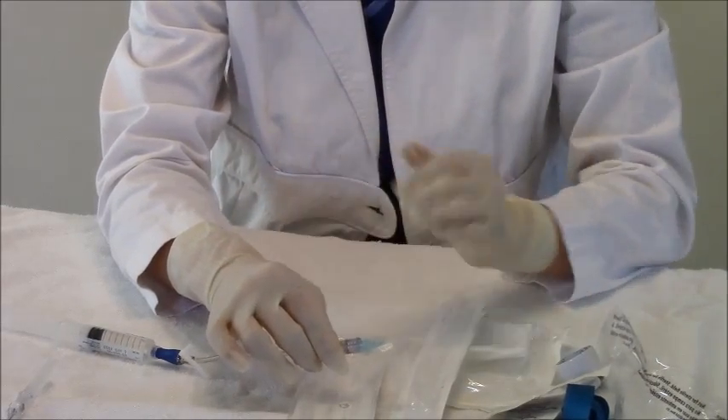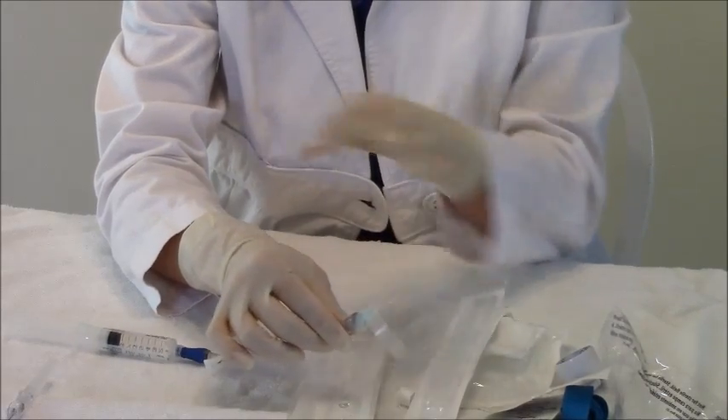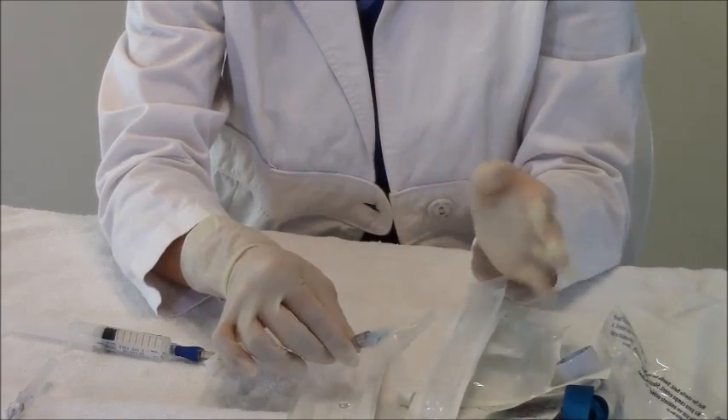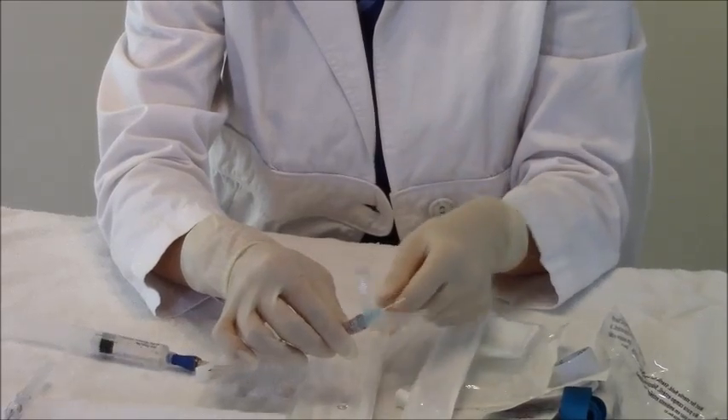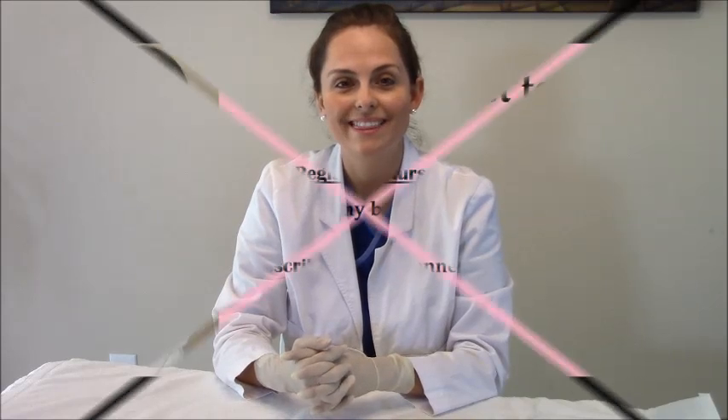Then use your tape that I showed you earlier to tape down the site. I like to put my tape underneath the wings and then crisscross it and tape it down onto their skin, have it nice and secured. Put a little tegaderm or whatever you have and tape it down. That right there is how to set up your supply. I went a little bit into actually starting the IV. I have a video on how to start an IV so please check that out. If you have any questions on different gauge needles, how to start an IV, or how to find veins, please check out my other videos on IVs. Thank you so much for watching and please visit RegisterNurseRN.com for more nursing school tips and nursing school help.